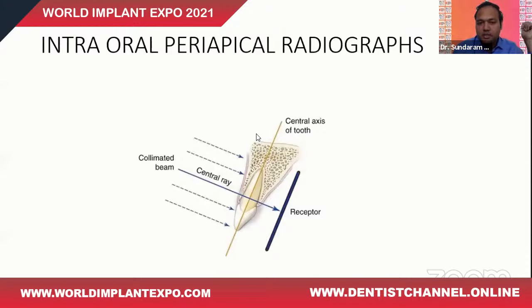A conventional intraoral periapical radiograph has a white film placed intraorally opposing the tooth, with the tooth of interest in between, and an outside X-ray source which passes the X-ray beam. So you have the paralleling technique and the bisecting angle technique through which you get the regular intraoral periapical radiographs.